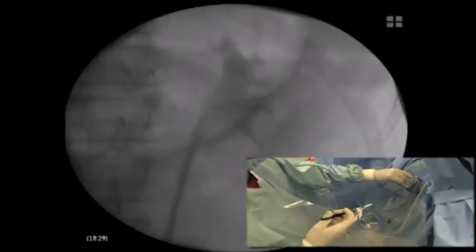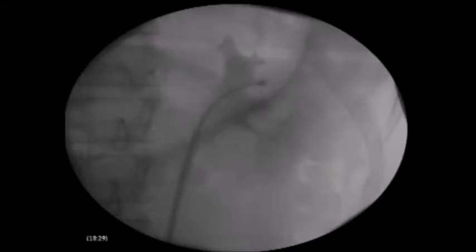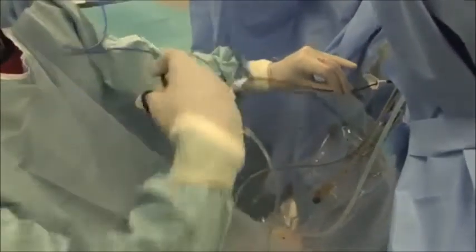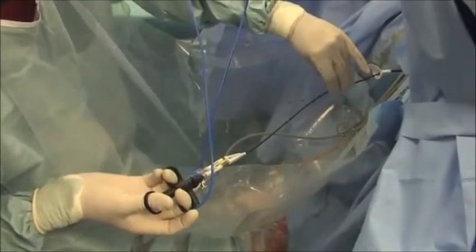It's noteworthy that the torque stability of this disposable scope is absolutely comparable to that of a conventional flexible ureteroscope, and in our initial experience has been good enough to allow us to always reach every targeted calyx. Another limitation of this device is the poor ergonomics of the handle, which has initially been designed to resemble a gastrointestinal biopsy device.